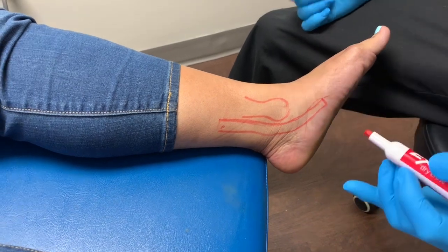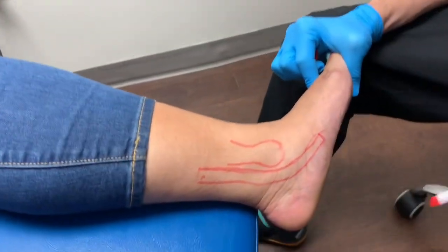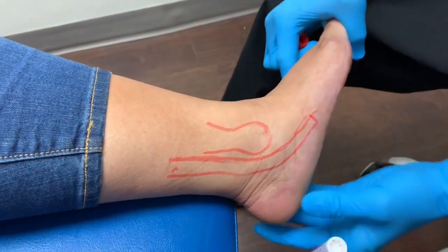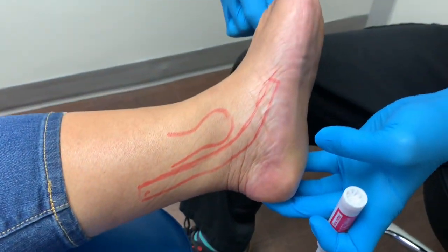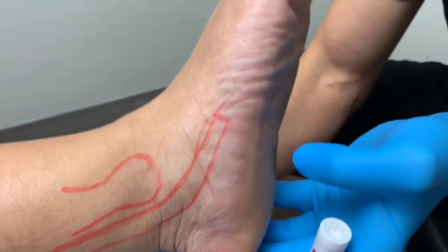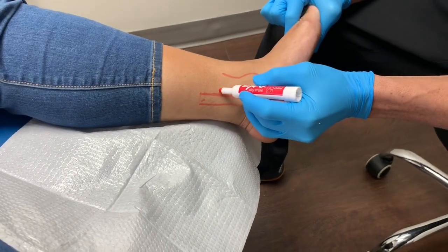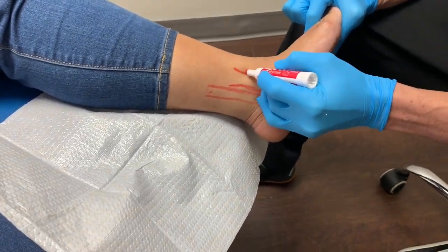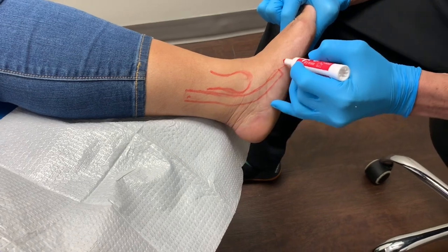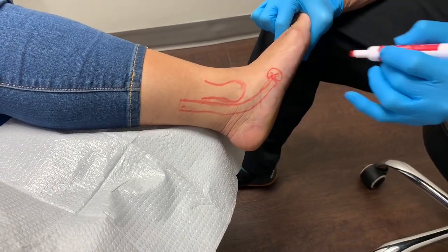Not only tendons, but really important neurovascular structures, such as a very important artery, vein, and nerve. Let's put that underneath. Thank you very much. Excellent. Okay. So here we have the tibia, which is the bone. And we'll make believe that this is actually the tendon. The tendon comes in, inserts here into the navicular.